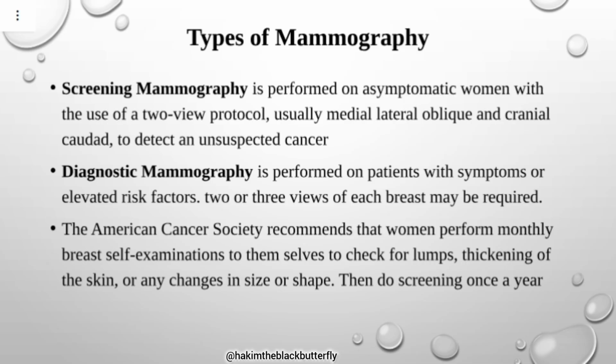Diagnostic mammography is performed on patients that have come with symptoms. Maybe they have pain in the breast, or they feel some lump in the breast or anything. So 2 or 3 views of each breast may be required. You can do many views to ascertain the presence of any disease in the breast.